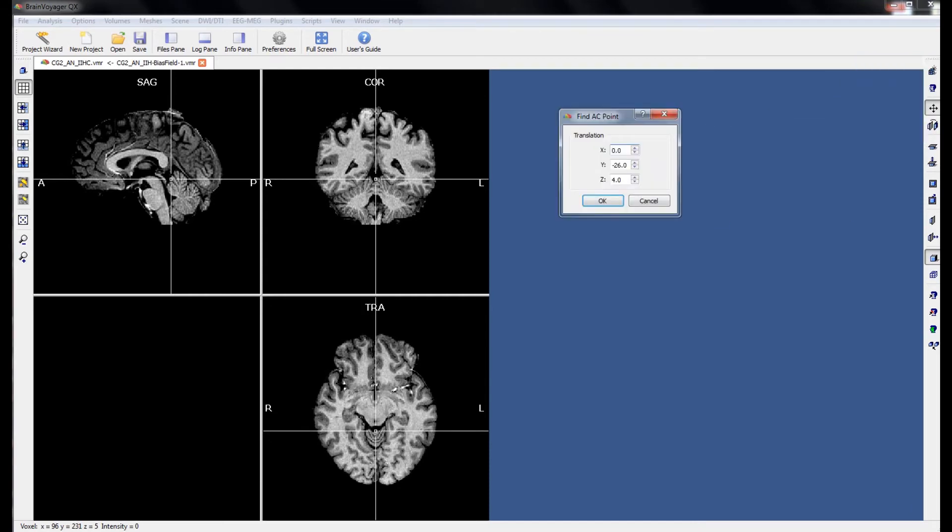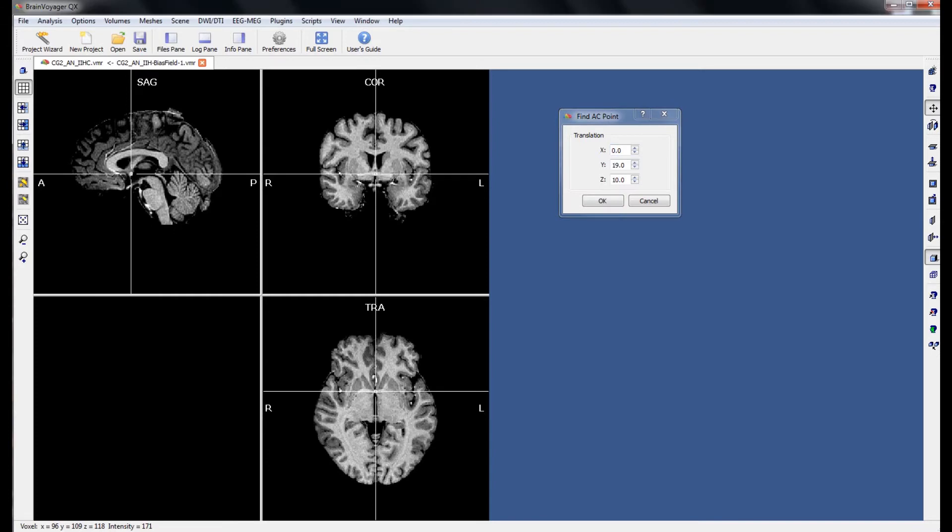To identify the anterior commissure, if you use the sagittal window, identify the corpus callosum, follow the fornix downwards you will find the anterior commissure. If we click on this point with our mouse cursor and turn our attention to the transverse window, you can see that the cursor is now on a little bridge that divides the two hemispheres, almost creating a U shape as it transverses through the brain.